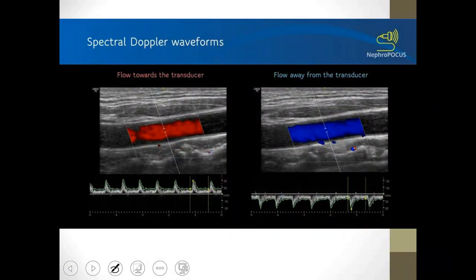For example, you will find the shape of the spectrum, which indicates the amount of change in reflection intensity in that region. You define a specific field of view and a certain area in a particular vessel, and it starts to give you results.